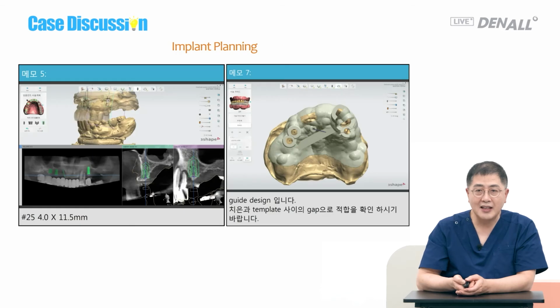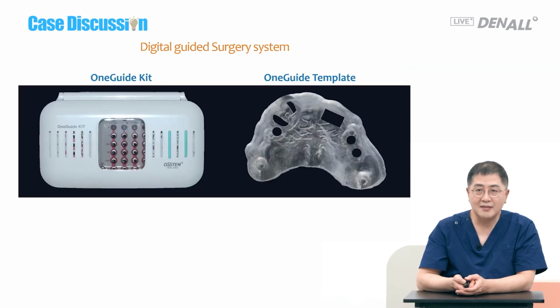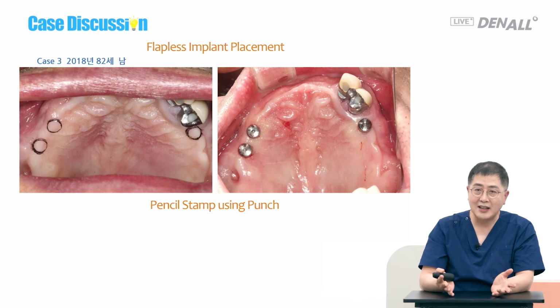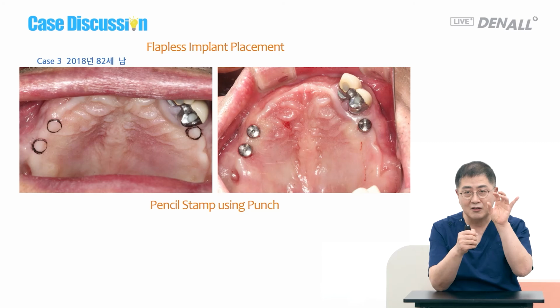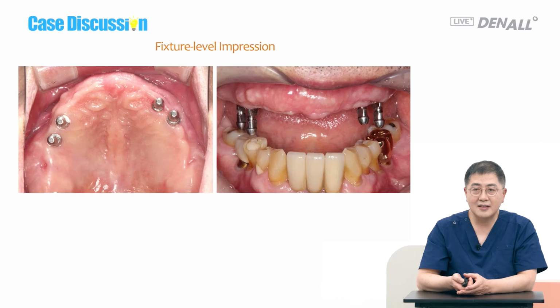And implants are placed at the left as well. RPD is done. Guided surgery can be used for accurate positioning. Surgery is performed. If necessary, I raise the flap, but as much as possible, when bone is good and soft tissue is favorable, I go for flapless surgery, which is less painful and the outcome is very good.